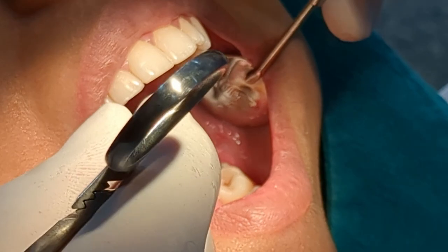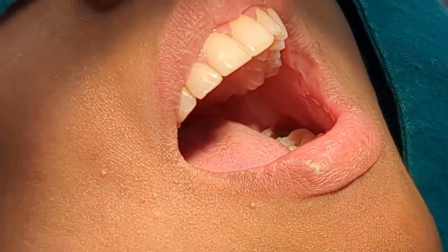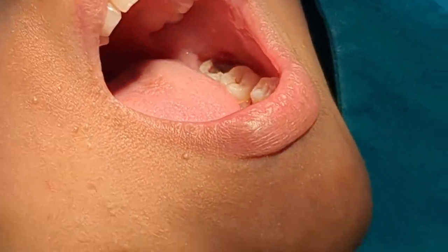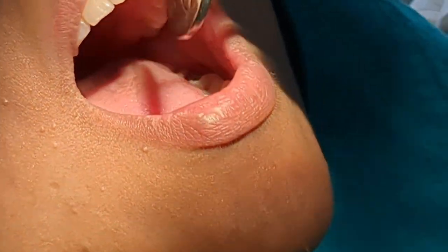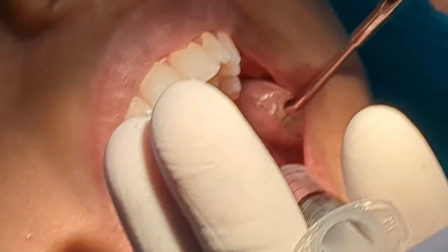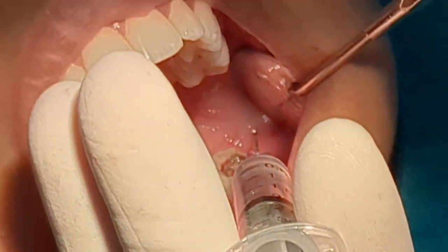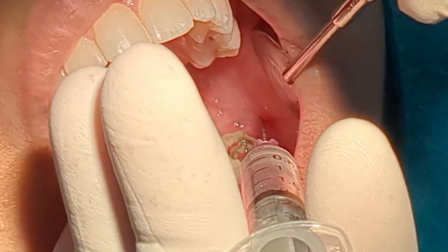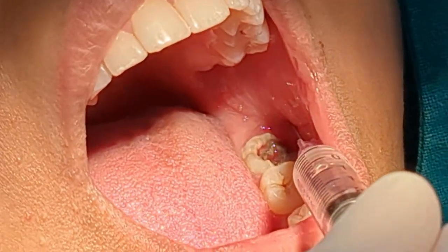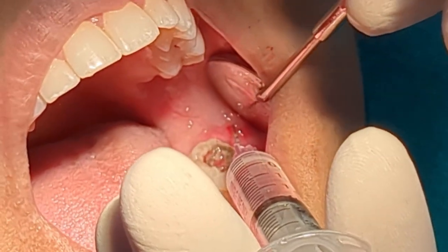You can see slight pressure being applied at the site. Now take a deep breath. I have hit the bone. I will aspirate, and then deposit — release the breath.